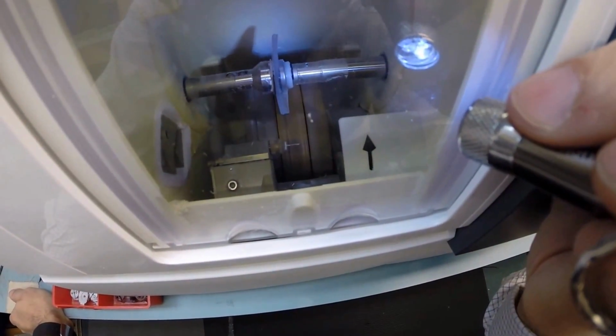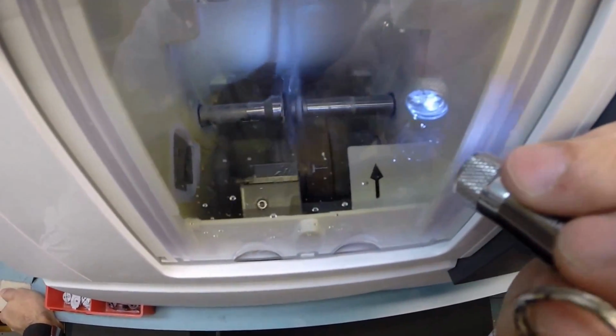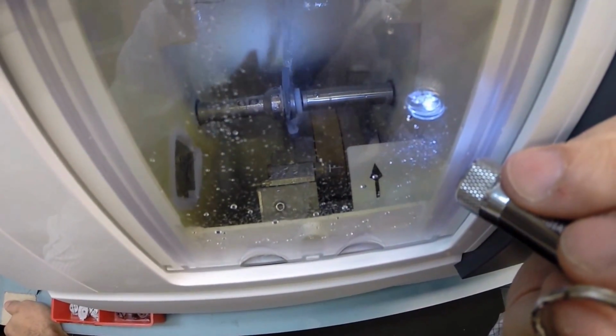Now if you notice, there is no water running. Of course, you wouldn't realize that. There's no lightning flashing, there's no band playing. But there we go, right on cue. Water begins spraying for the last 20 seconds of the cutting cycle just to wash away any optical debris.